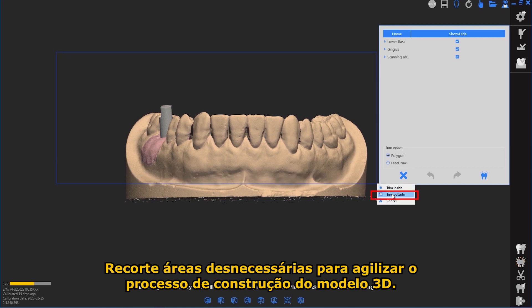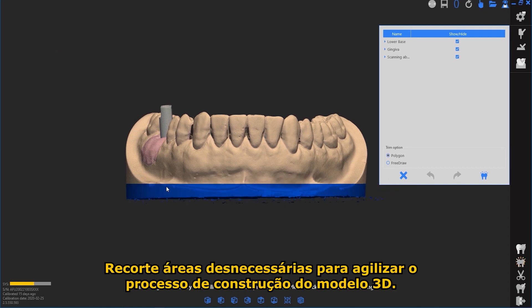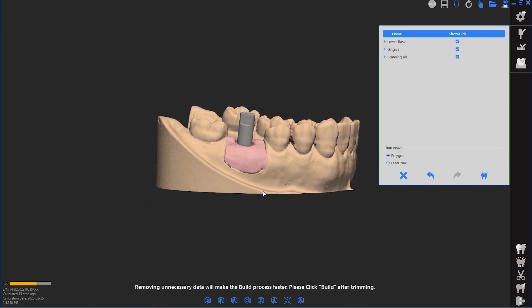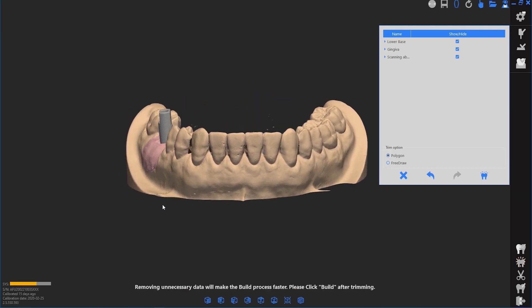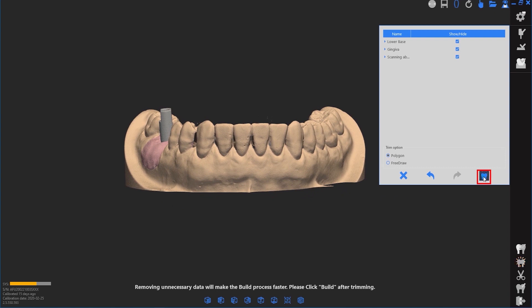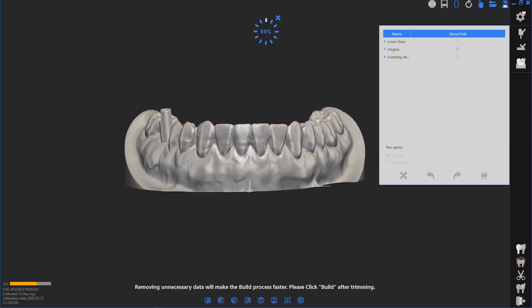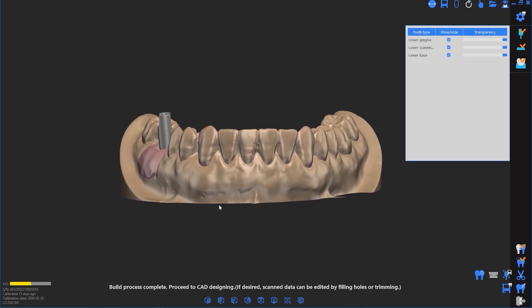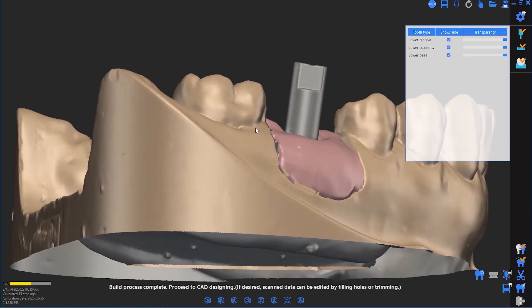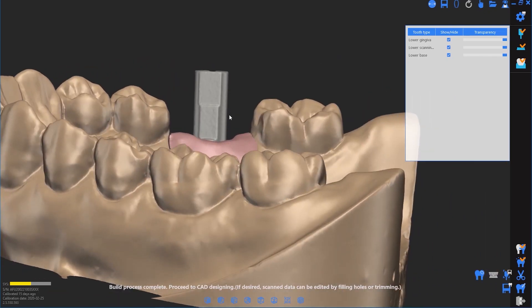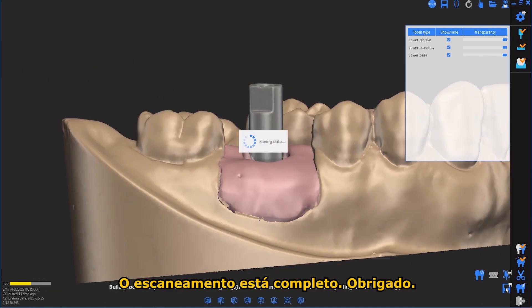Trim away excess data to expedite the build process. Scan is complete. Thank you.